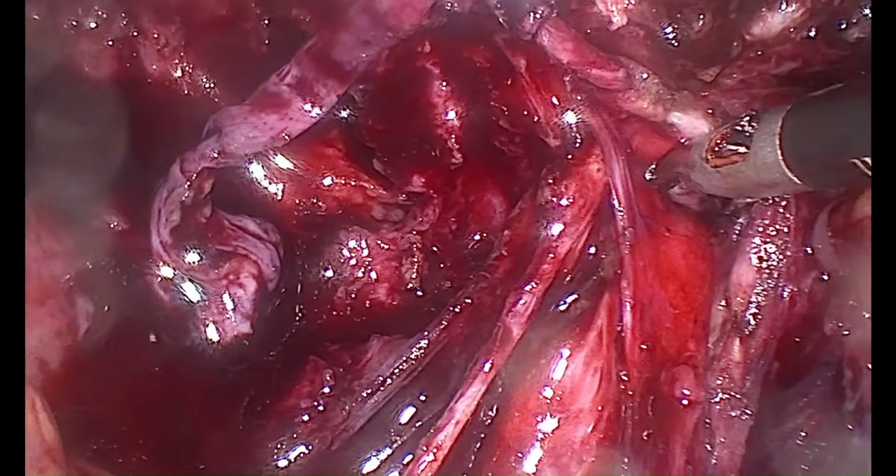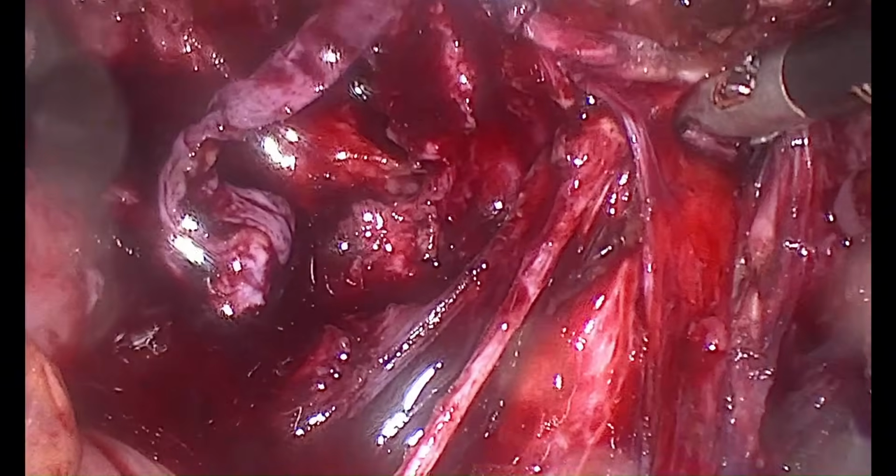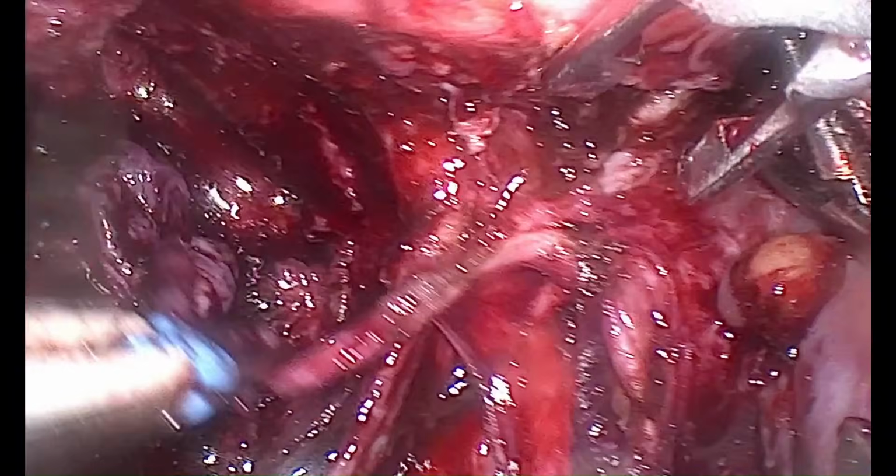Now I have reached the tunnel, and this is called the ureteric tunnel, and the ureteric tunnel dissection has been completed.